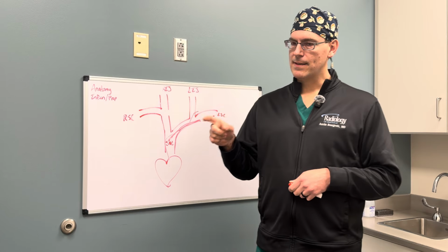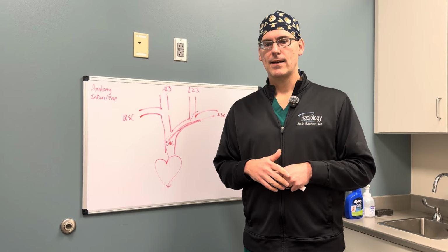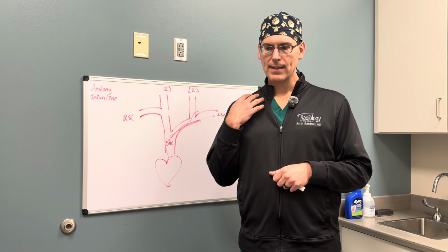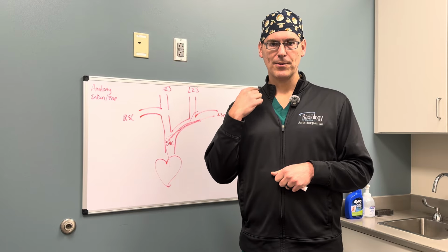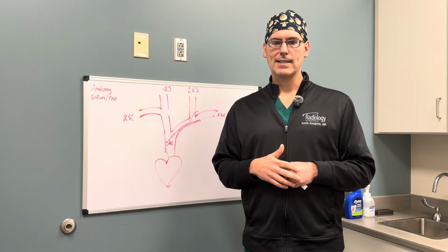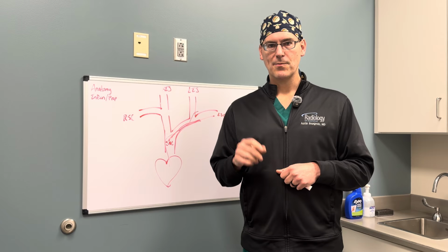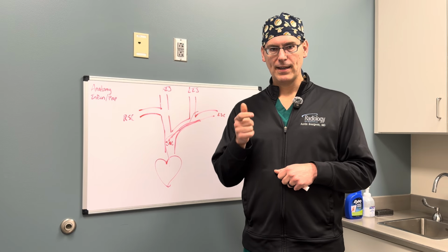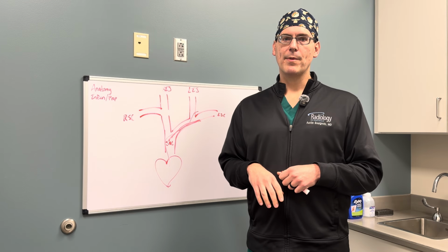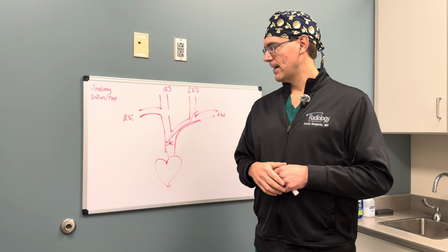The last thing, specifically for ports, is port size, and I think this is subjective. I think most operators are of the opinion that if the patient is large enough that you can't visibly see the clavicle, then that's a pretty good indicator that the regular large size port is appropriate, because it has a lower rate of flipping and it's easier to feel and use given its larger size. And more or less everybody else can have what we call a mini port reservoir. So I hope that helps.